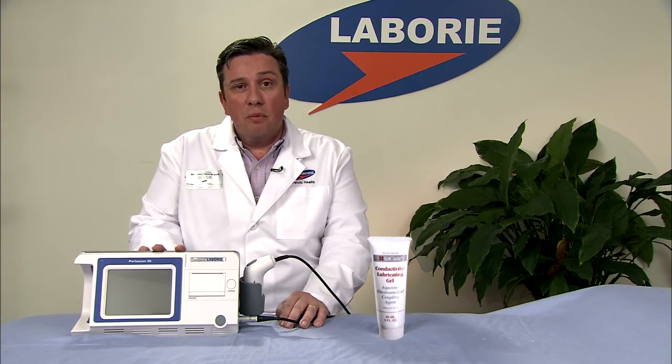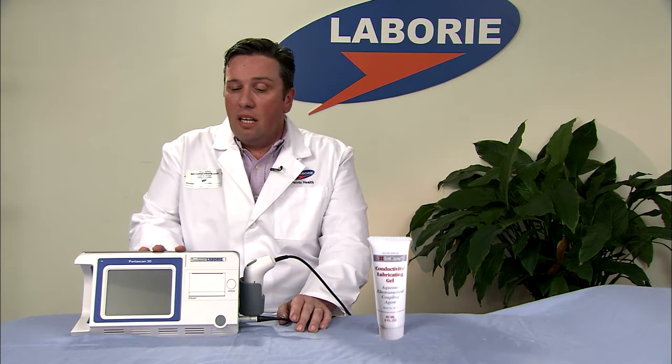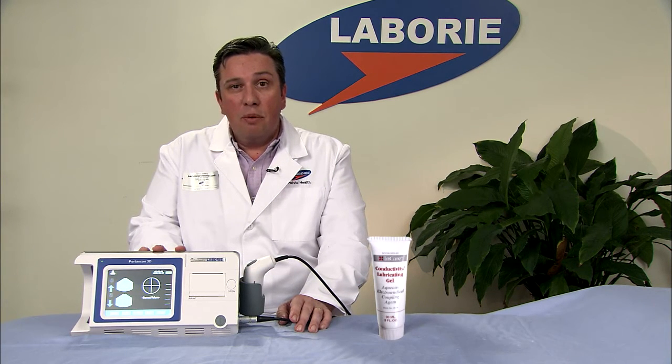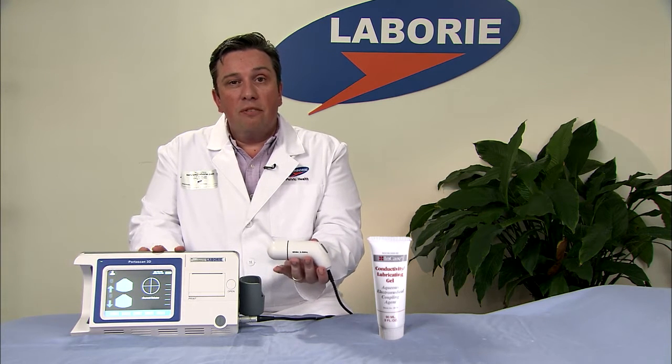This system is very portable and compact, and very simple to use. Its primary function is to do PVR scans post void. The system will turn on very simply — it uses battery power so it's completely portable, and boots in about 10 to 15 seconds to enable you to start scanning. At that time you have a probe conveniently held in the holder — a 2.5 MHz probe — and you're ready to start scanning.